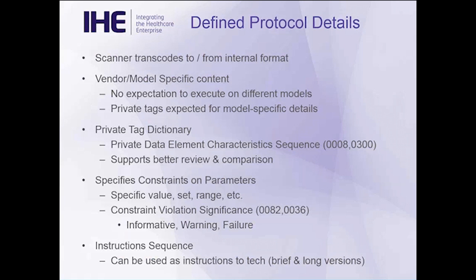We expect because of that there'll be a fair number of private tags included because each particular device will have certain model-specific details that are relevant to it, but not relevant really to any other system. So we expect it to be fairly normal for there to be private tags in there, alongside a number of public tags, which hold the very common types of parameters.